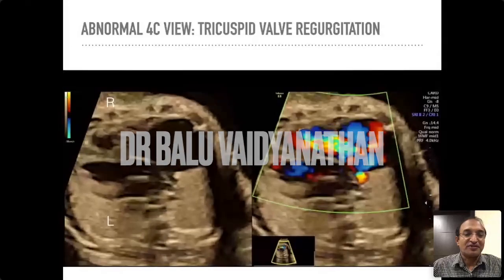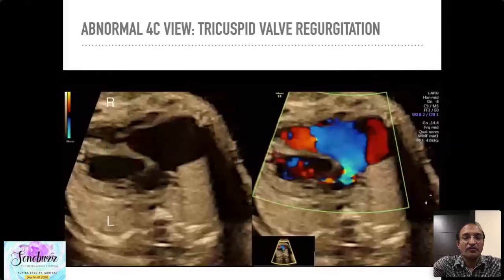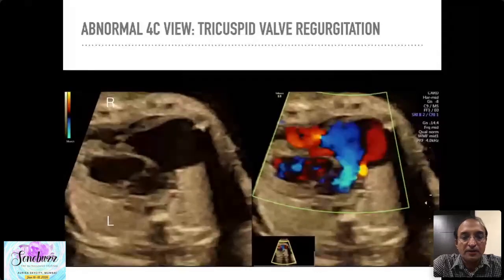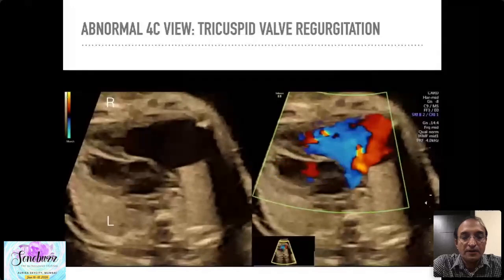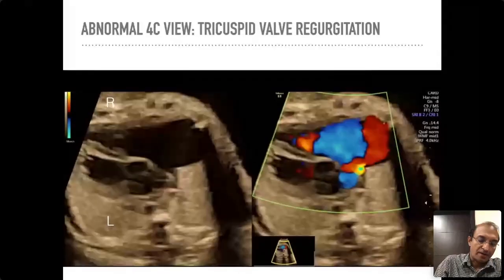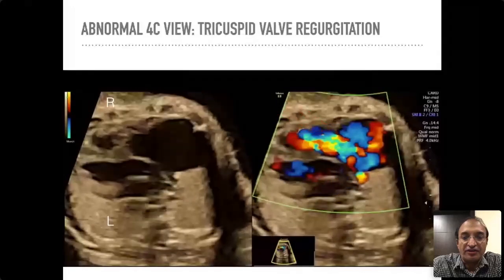This is a picture-in-picture image — grayscale on one side and color on the other. Most of you would call this Ebstein's anomaly with severe tricuspid regurgitation. I just want to pause and suggest that not all tricuspid regurgitation is necessarily Ebstein's. I'm going to bring in one more condition for the sake of differential diagnosis.